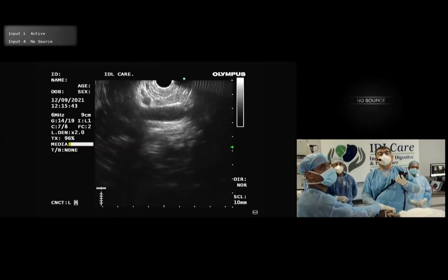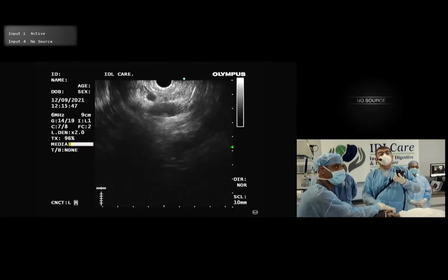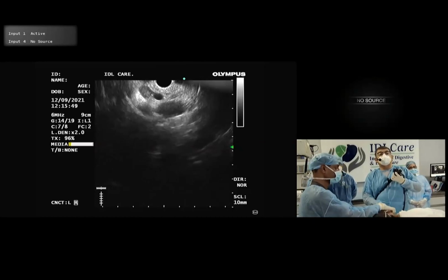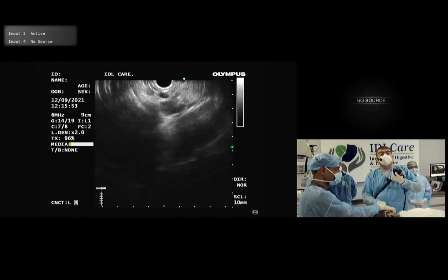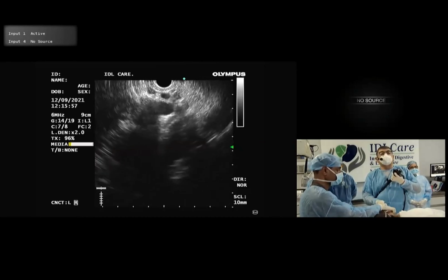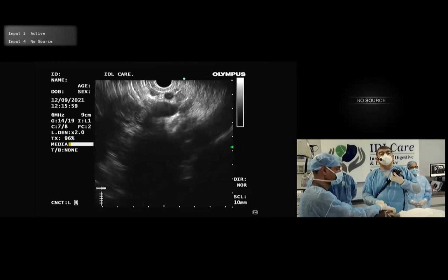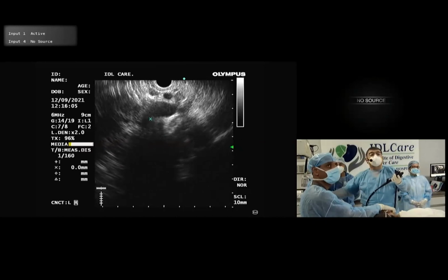See this? We are tracing. Either you trace the portal vein or you trace the bile duct. See this? Now we see that there is something in the head. Freeze. Immediately I know, because I cannot trace the portal vein fully here. See this? There is something here.